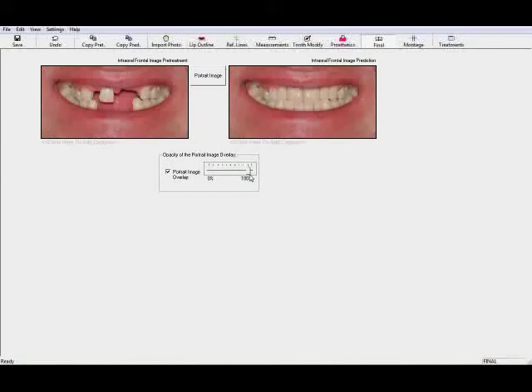With this program, you're able to demonstrate to the patient what you're aiming to do, and also the laboratory technician can be fully informed of your aim of treatment. This is not only a time saver, but also financially it makes it a lot easier, and you have patients knowing what they're letting themselves into before any money is being spent.